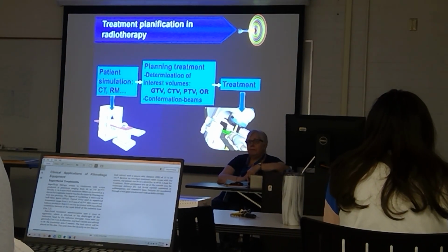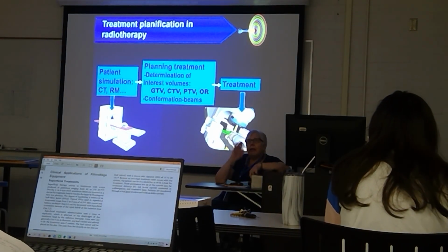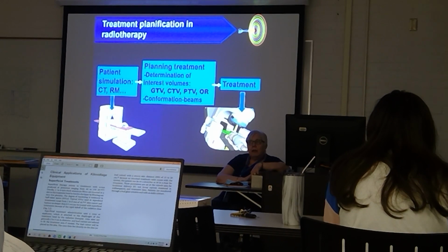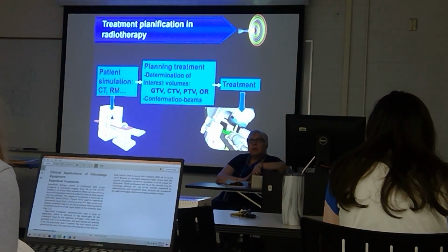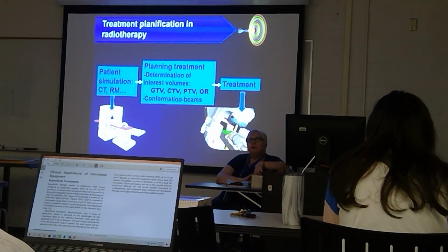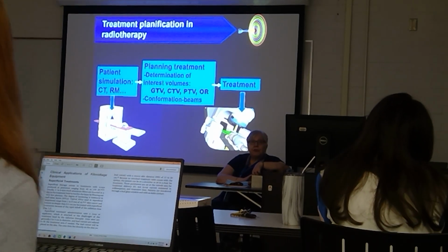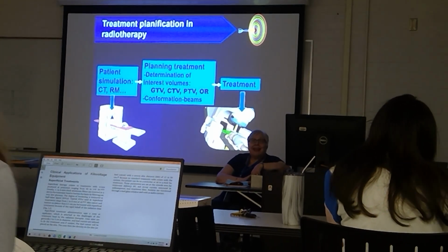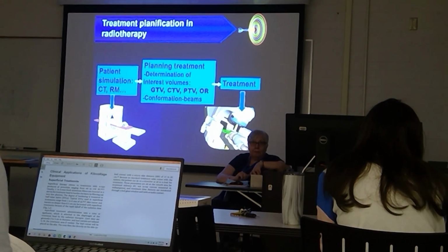Ultrasound, yeah, has been and is still used in some cases, and MRI. What else? Fluoroscopy. If you had a fluoroscope in the treatment room attached to the treatment machine, then yes. If you had to move the patient, no.